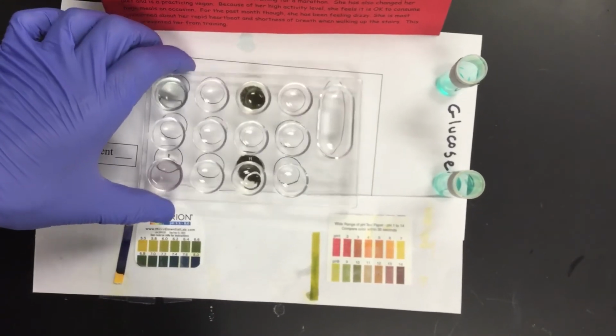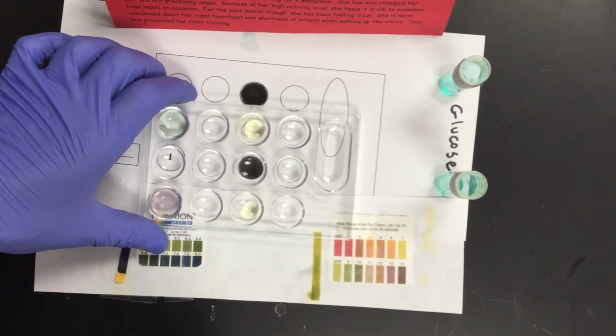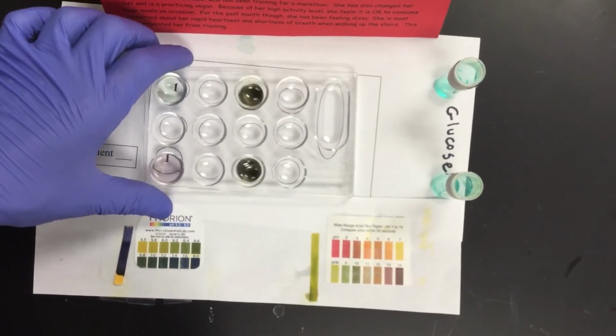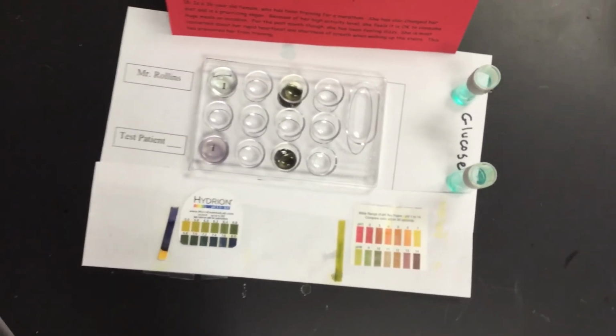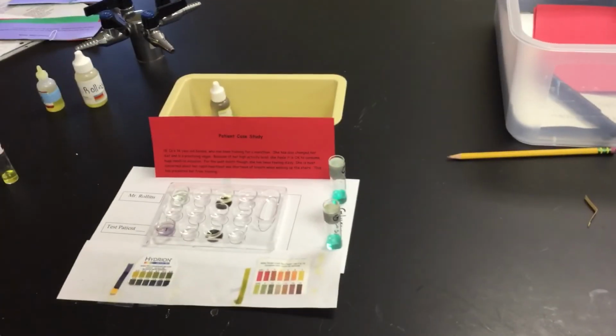These two samples, both Rollins, I'm going to slide them down so you can see a little bit as well. Both Rollins and test patient number 18 are clear. There's no white cloudiness to it, which means that Mr. Rollins as well as patient number 18 are negative for chlorides.